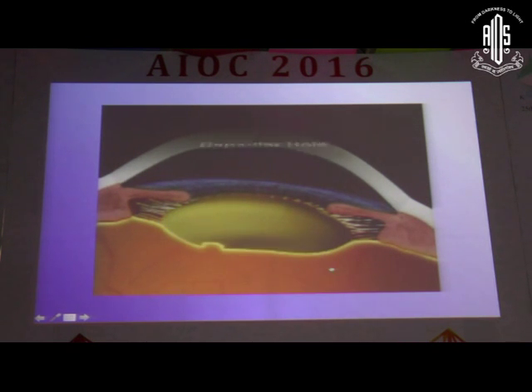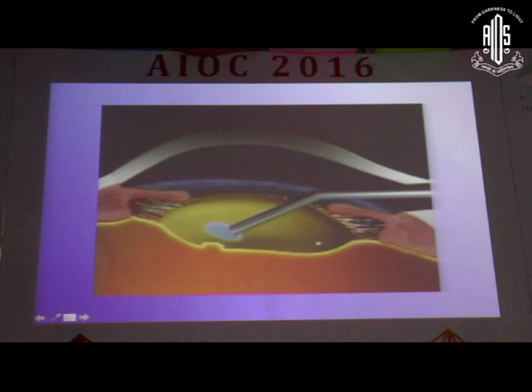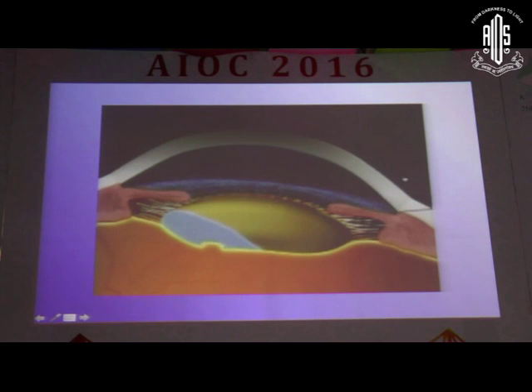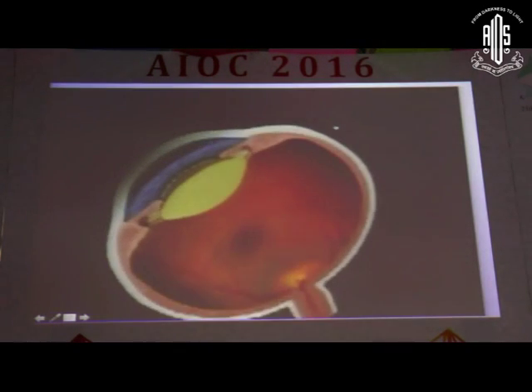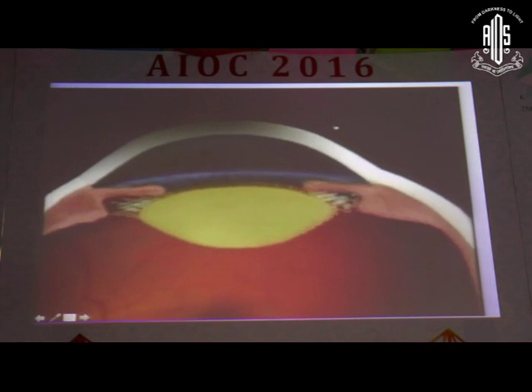Imagine that this was a capsular hole, but if there was a floppy iris or anything like this, or if you see that the bag is also very lax or there is a zonular dehiscence, I'll show you one more which can lead to other problems. So this is how you can use both these viscoelastics, the dispersive and the cohesive ones, to actually help yourself.